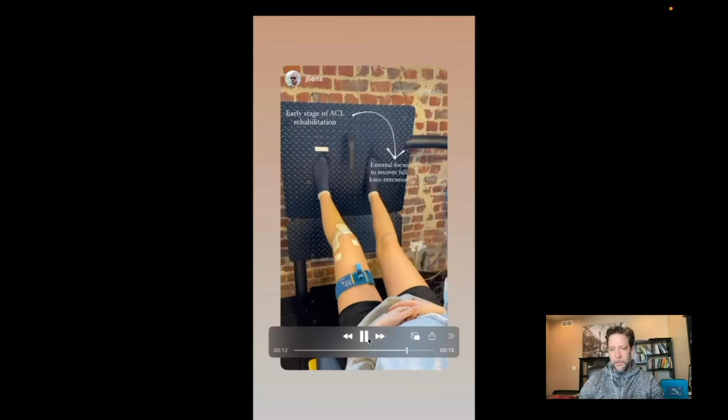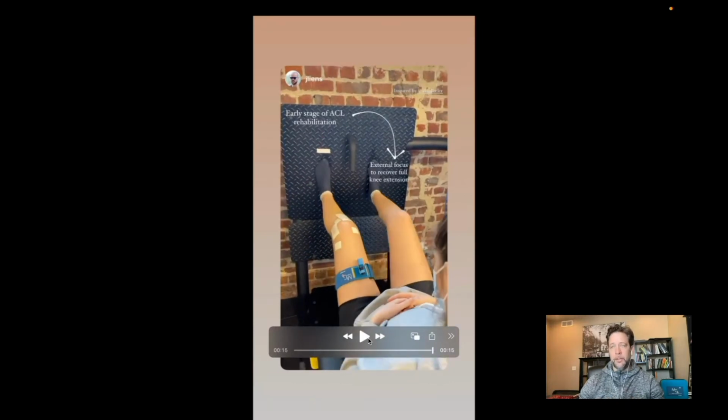Hopefully we're all well aware of Gabby Wolf's research now, some even coming from Dusty Grooms from the University of Ohio. David Sherman just put out an external focus of attention study using our laser in 2021. You can look for that. I believe the title was something about performance and balance. These are really great for skill acquisition and for learning. Okay, learning being long-term reproduction of the skill, not just performance, which would be the immediate reproduction of the skill. Learning and retention are going to be synonymous in this case.